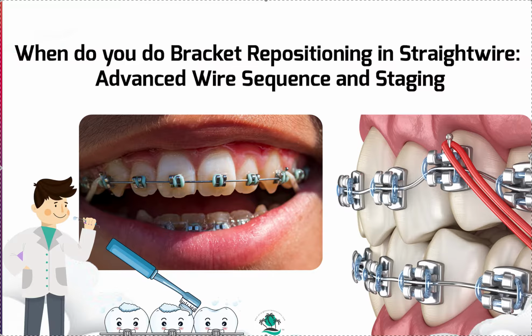Why? Because direct bonding has to be done by the doctor, so it's managing doctor time. If we do indirect bonding, then you could do 5 starts at 5 p.m. on a Friday, which you normally couldn't do. So that's why we do it. And also, hey, I'm pretty good at placing brackets, but sometimes I'm not perfect. Sometimes I just can't see, it's too dark, I'm standing on my head, or the assistants can bump it when they're light curing it. So the benefit of indirect bonding is that everything goes on perfectly.